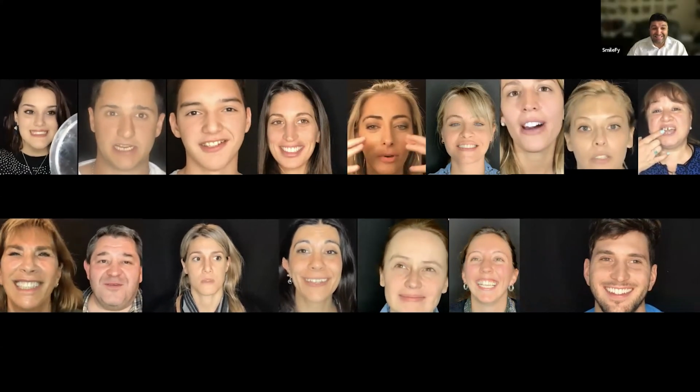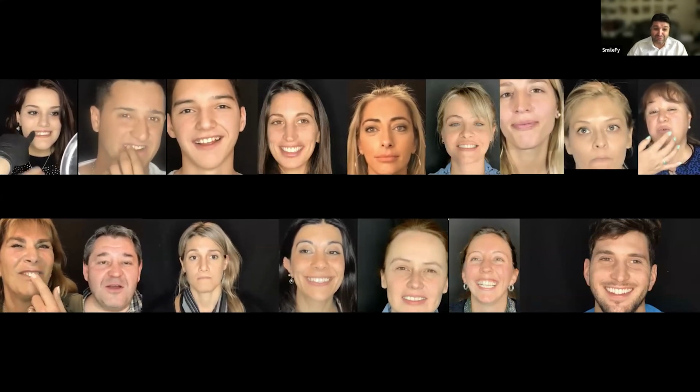We need to take a video because the movement of the lips and teeth and people talking is very, very important for making the decision for the design. So the video recording or the video interview of the patient is so important.